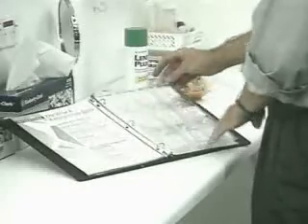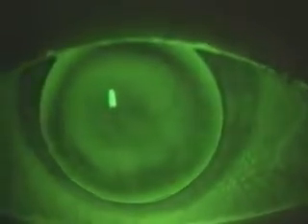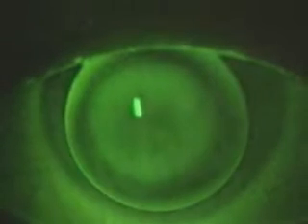An optimum fitting minimizes the risk of lens-related tissue damage. Successful RGP lens fitting for keratoconus requires an extensive range of trial lenses that are suited to mild, moderate, or advanced cases. A golden rule for the keratoconic eye is that the best fitting trial lens must be as close as possible in design and power to the ordered lens.